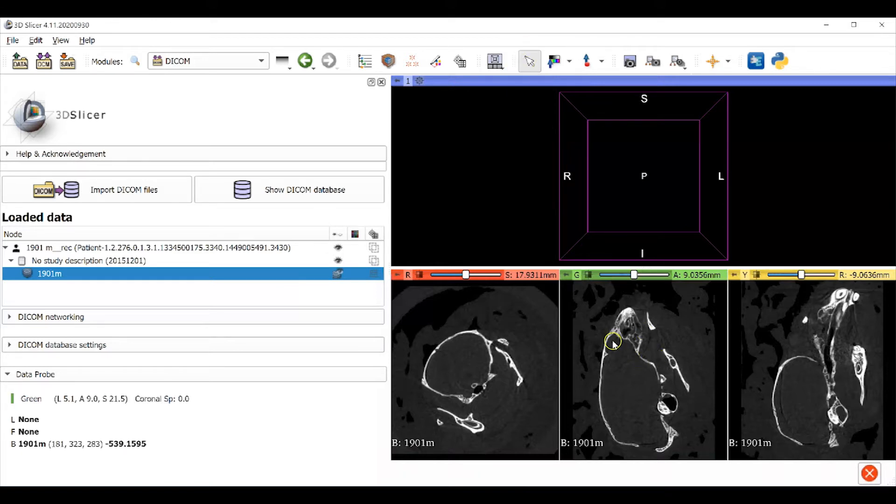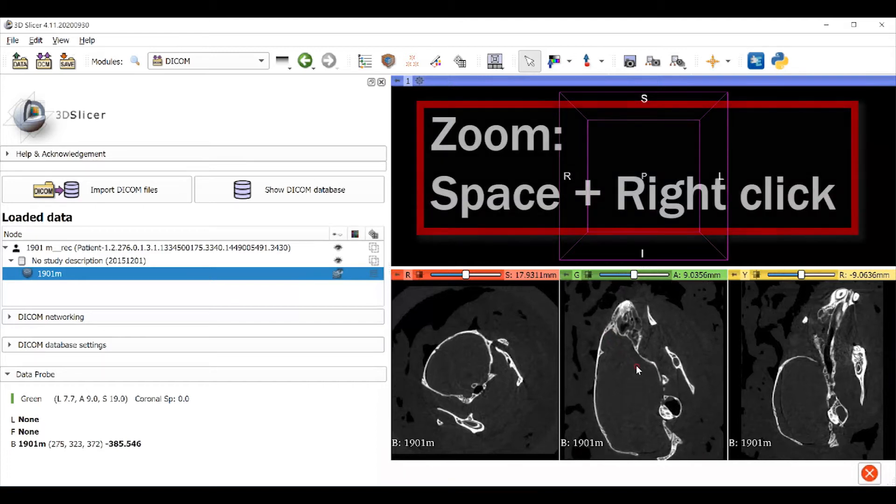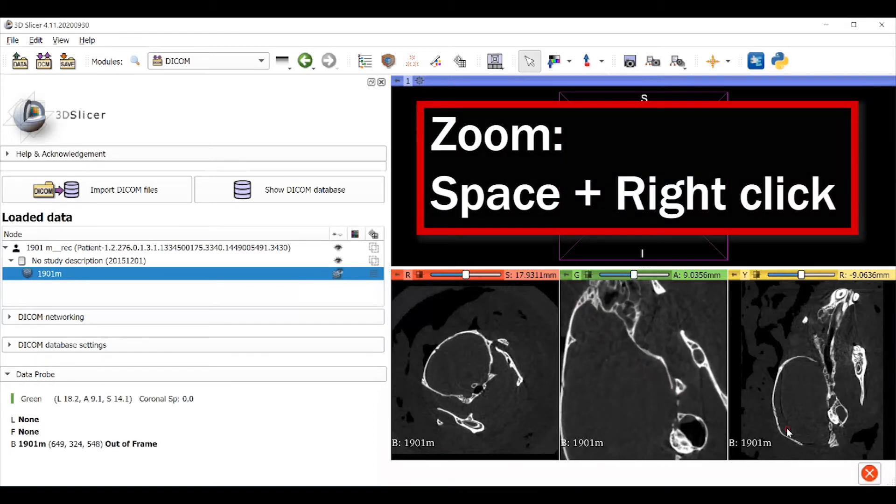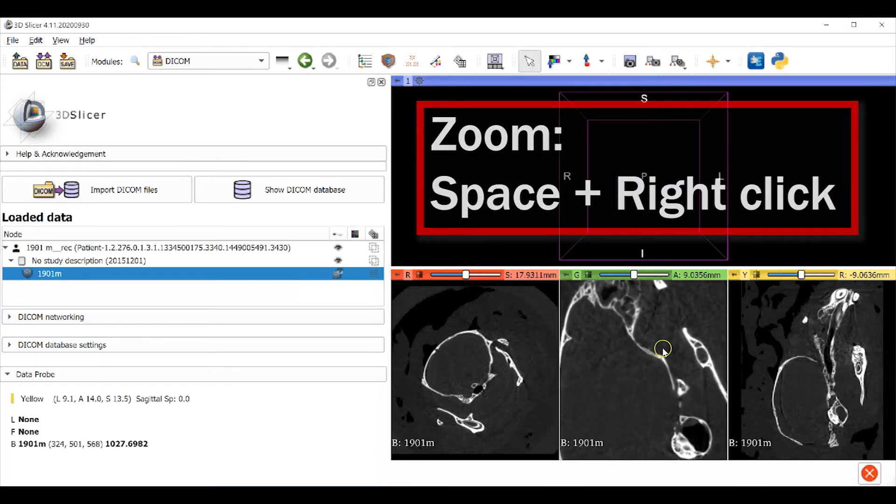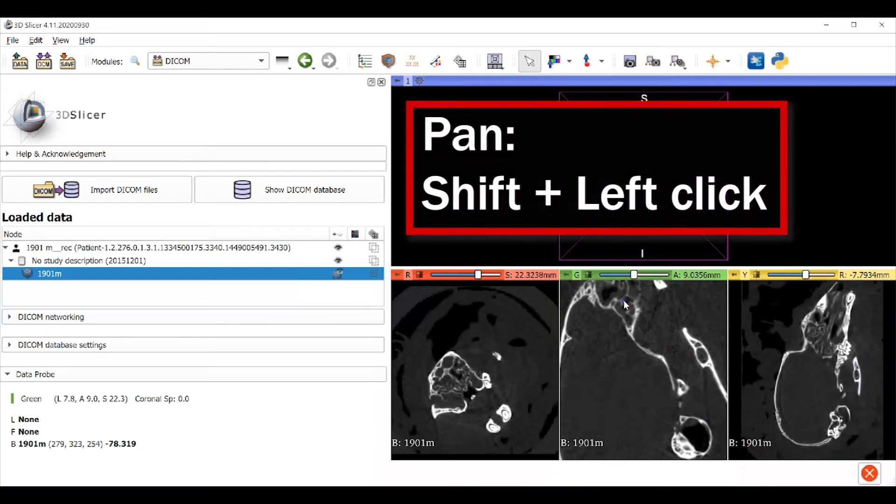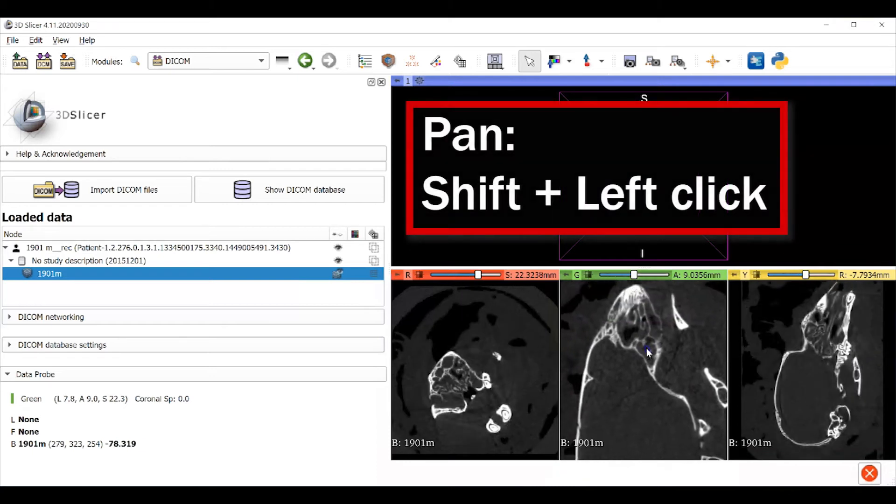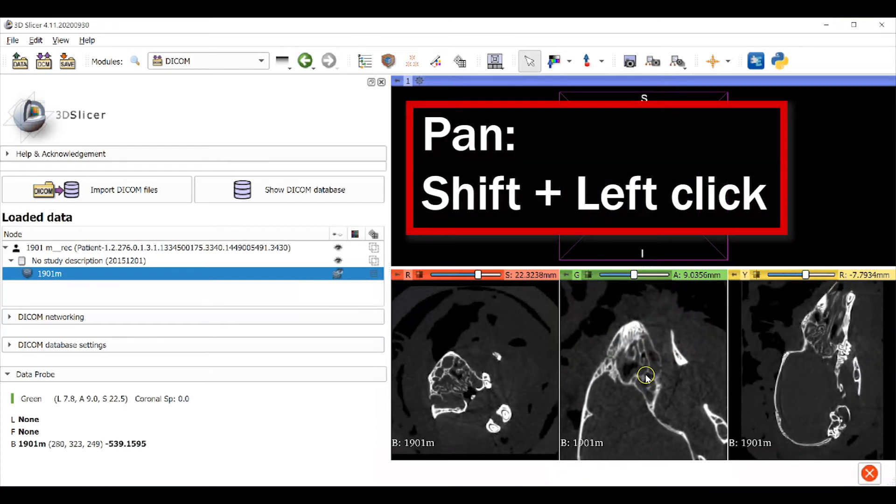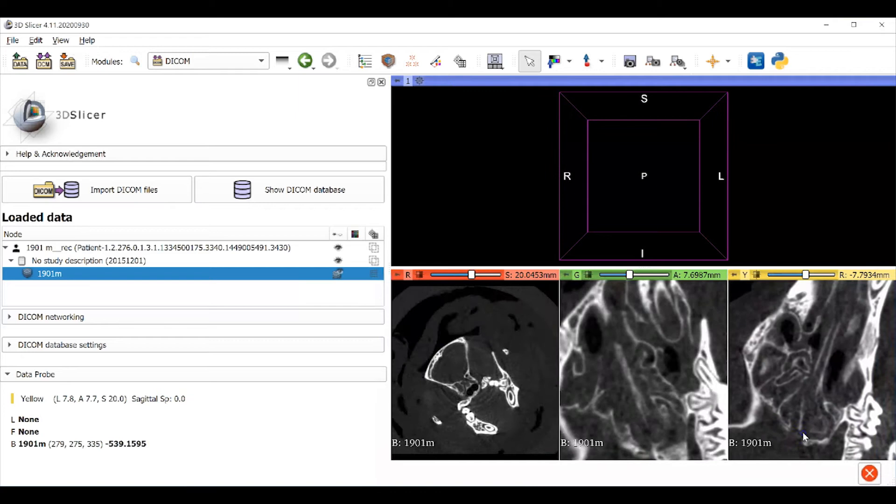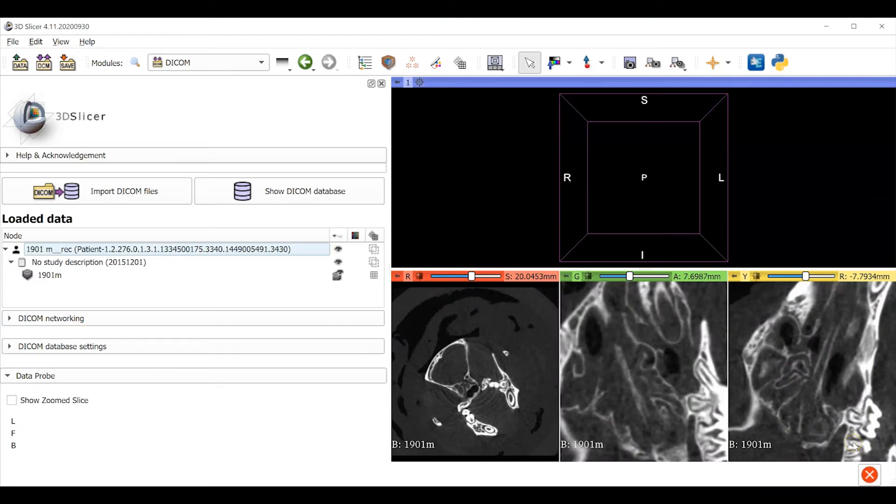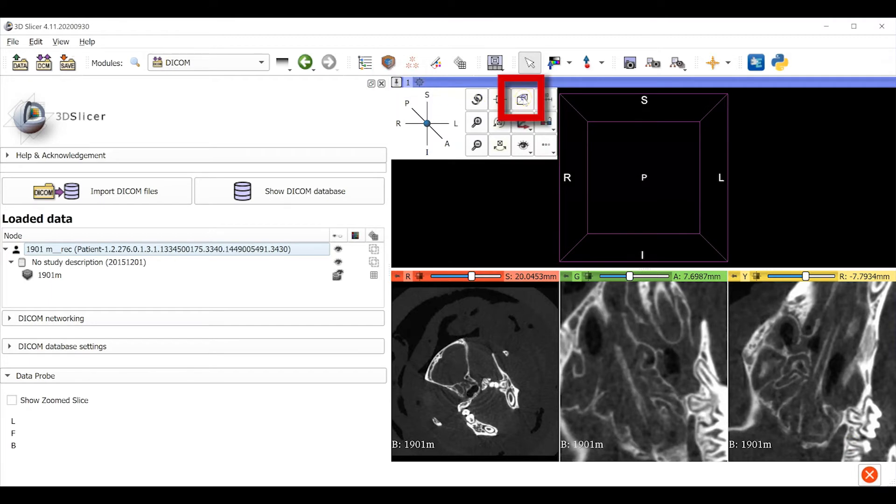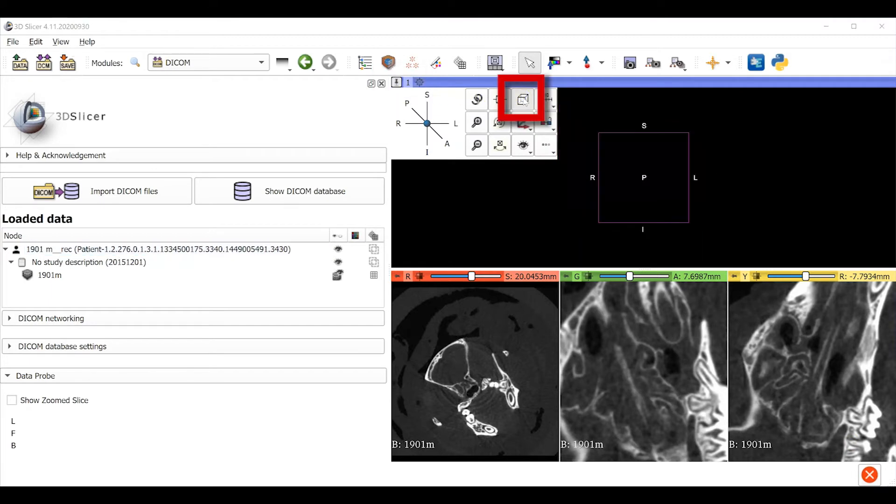You can also control the view in each one of the images. The space bar right-click and drag lets you zoom in and out. Shift-left-click and drag lets you pan the image or move it around in the window. I always prefer to use the viewer control menu behind the push pin icon to switch the 3D viewer from perspective view to orthogonal view.